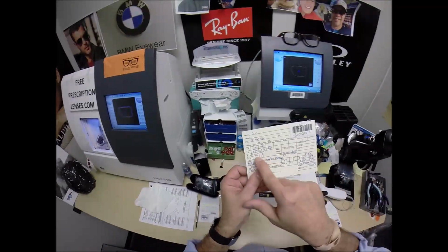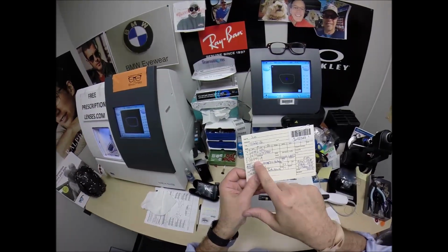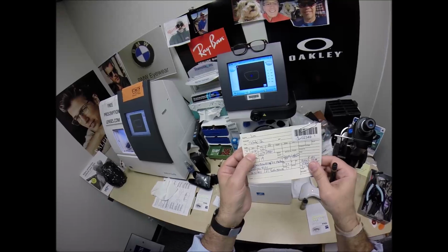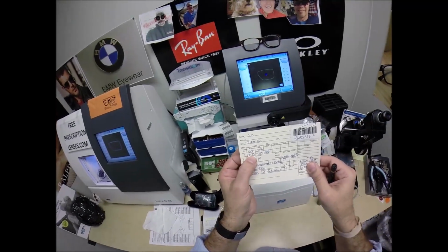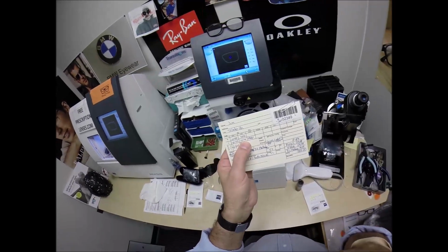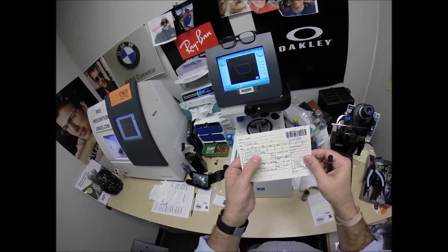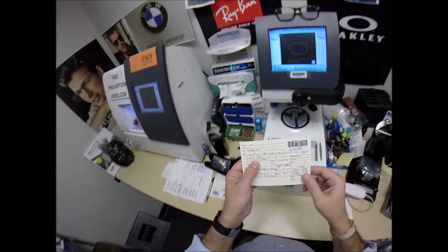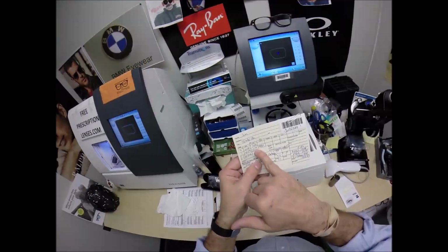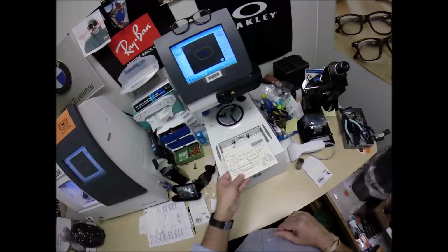It means in addition to what's up top for the magnification up close. So, if you were to get over-the-counter reading glasses, you would subtract 50 from the 175. So you need a 1 1/4 in the right eye and about a plus 1 in the left. Of course, the over-the-counter reading glasses do not correct for astigmatism correction or offer you the perfect pupillary distance. And so, that's why after a while you'll get eye fatigue even with reading glasses, because you're still having to strain to make out the clarity.